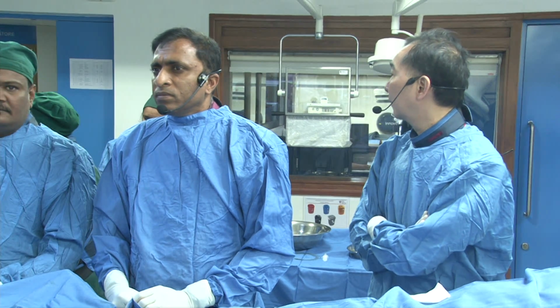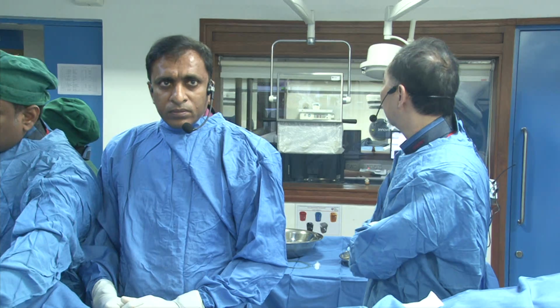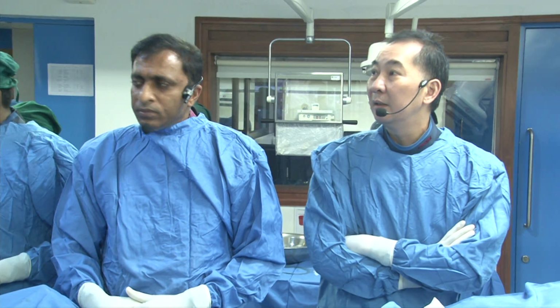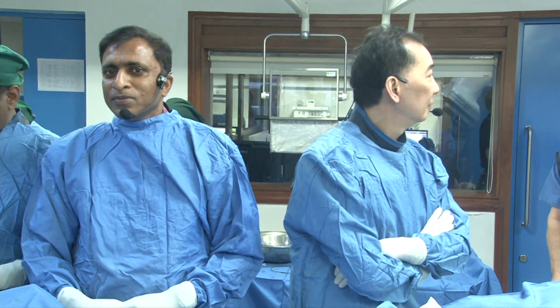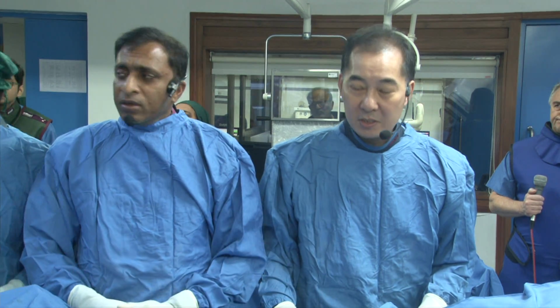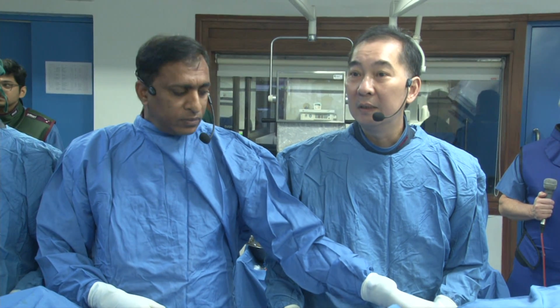Good morning. Can you guys hear us in the lab? Yeah. The mic's on? We are on? Hello, panelists? Hello, TRICO? Good morning, Dr. Tuck. Yeah, we can hear you loud and clear. Excellent. Good morning, everyone. So, do you see the case? Do you see the angio? Yes, we do. Okay.